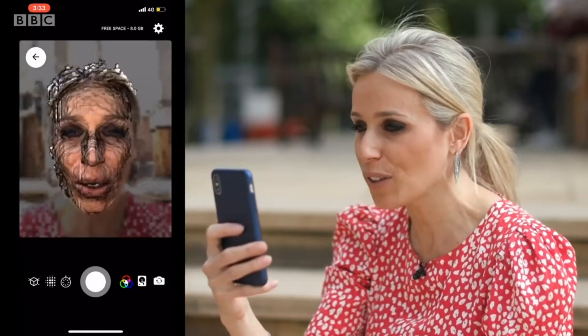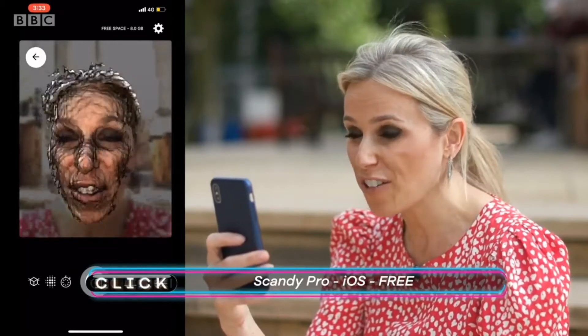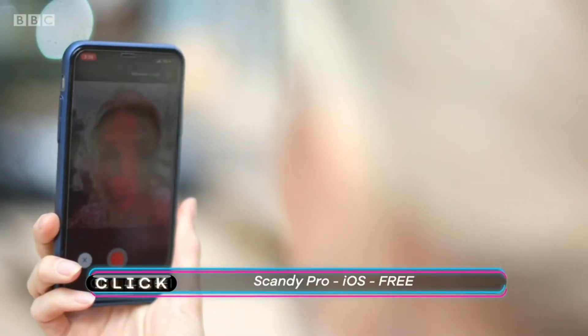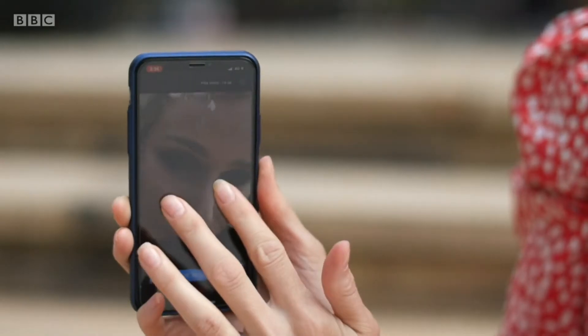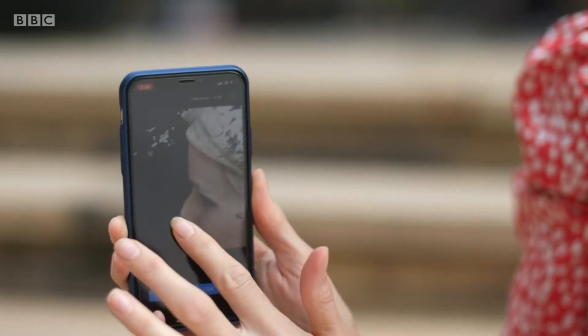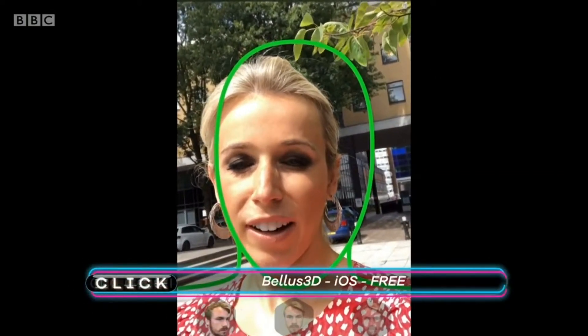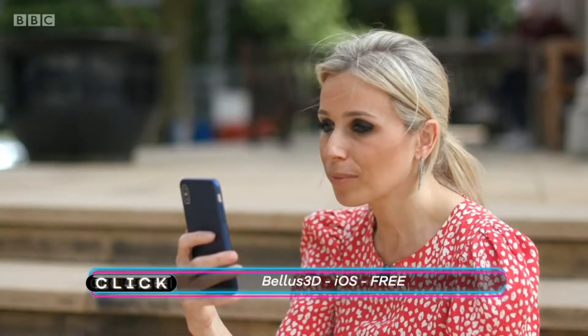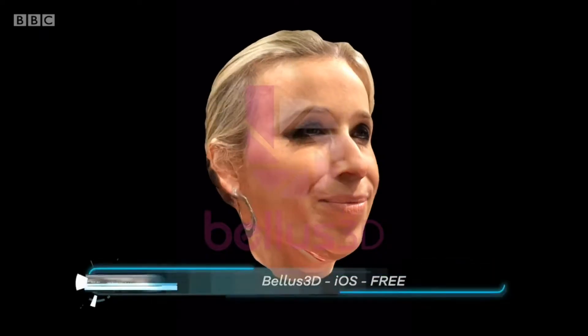First thing I need to do is scan my face. There are a couple of iOS apps that seem to work to do this. The first app is called Scandy Pro — I'm going to have to hold very still. Although it was a little fiddly to get the image right, I'm told that this app is especially accurate. There's also Bellus 3D, which I thought was simpler to use. And Virtual Me did look pretty realistic. I guess I'll just find out how the mask fits when it actually arrives.